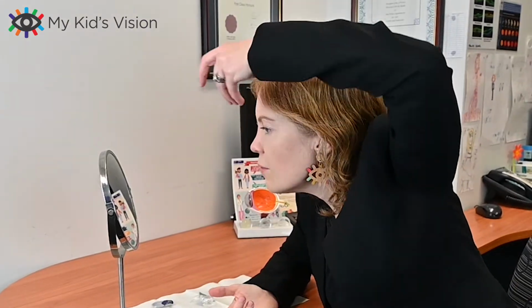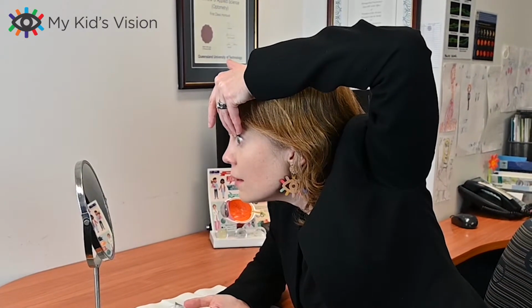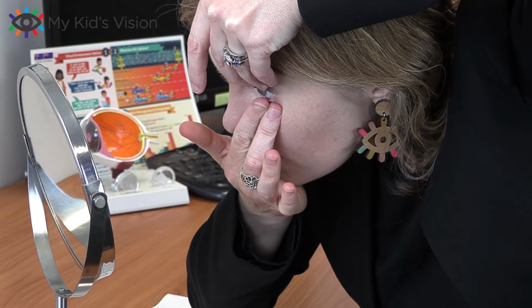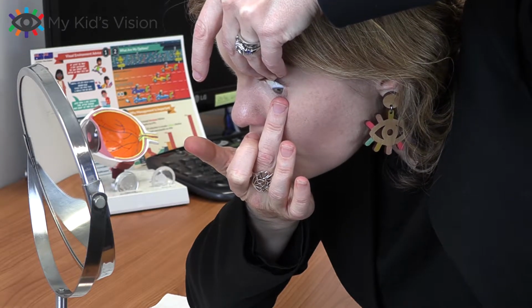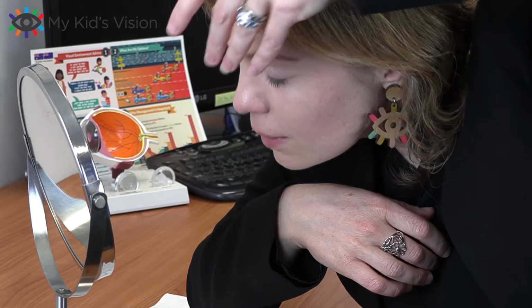So I'm looking at myself in the mirror. I'm bringing my left hand over the top to hold my top eyelid. My middle finger is holding my bottom eyelid, and I'm just going to gently place it on the white of the eye. Now it's sitting there a little bit low, so I'm going to look down towards it. That helps it settle up over the colour part of the eye. Let go of my bottom lid first, and then last thing is let go of your top eyelid.